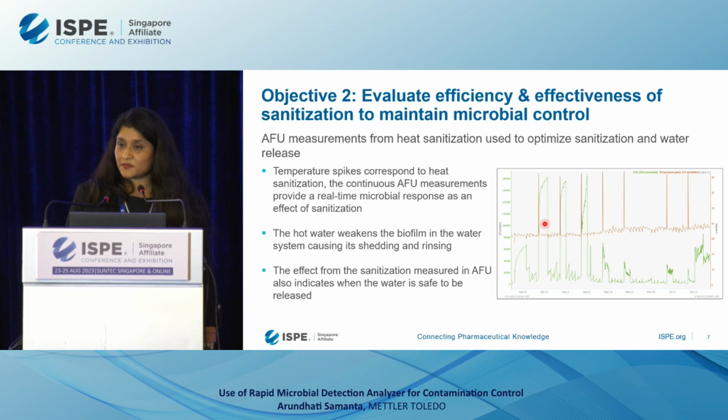Again, this is something which you will be more and more acquainted with your water system when you have an analyzer online. And this basically tells you, if you see in between the sanitization, is my sanitization effective? Should I do some optimization? Can I do my sanitization a week later? Those are the decisions customers are usually able to make from this information.